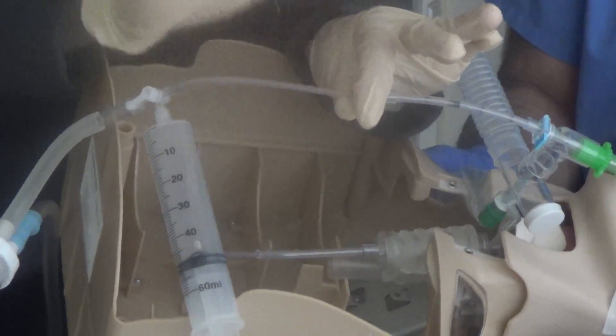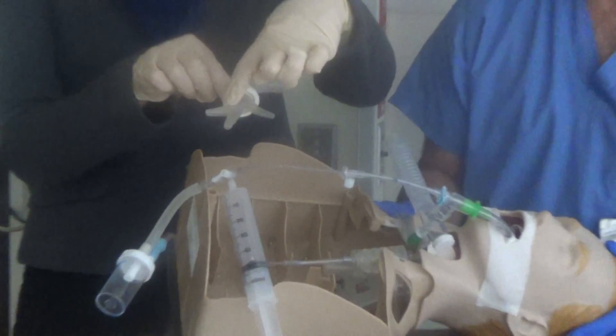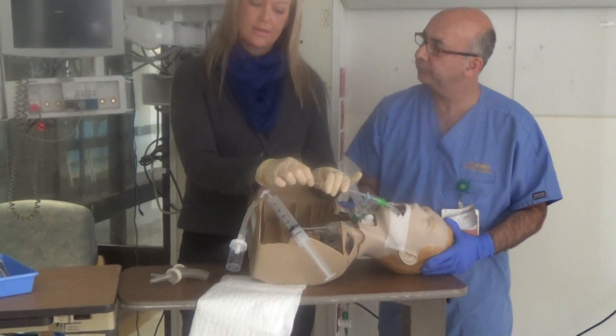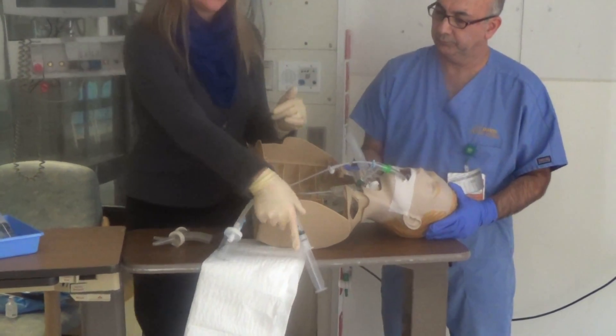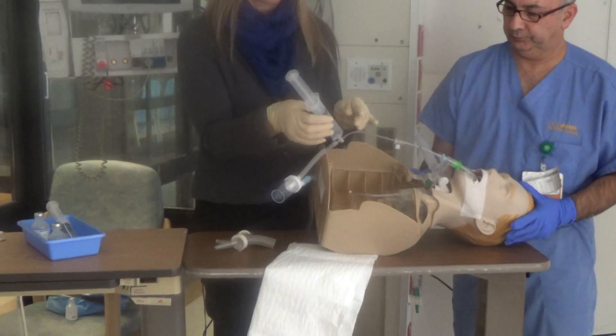Once you feel resistance, to determine that you're not in a bifurcation, if you feel resistance and you are at a bifurcation, simply pull back the catheter slightly and advance again until you feel resistance in a wedge position. At this point we are in the position we want to be in the airways, and this is where we begin our lavage and instillation of saline.